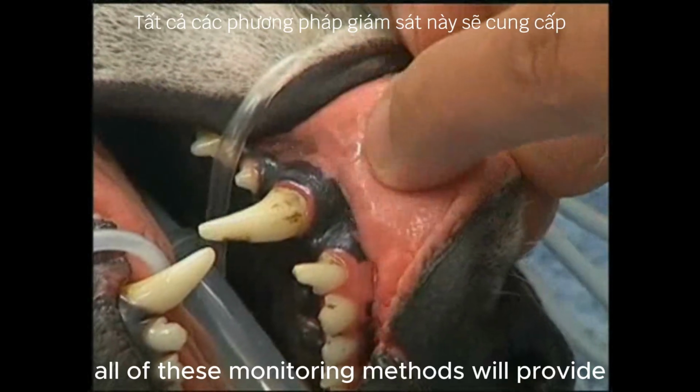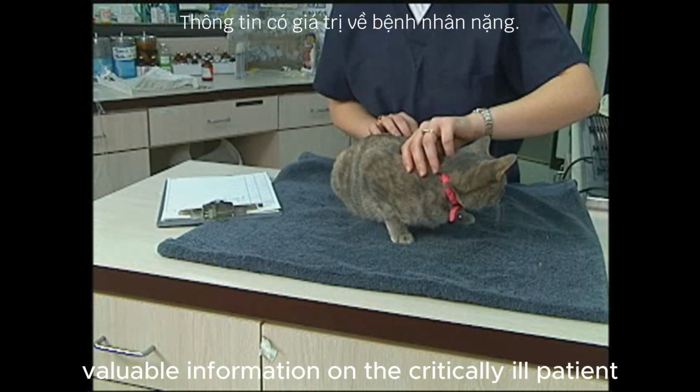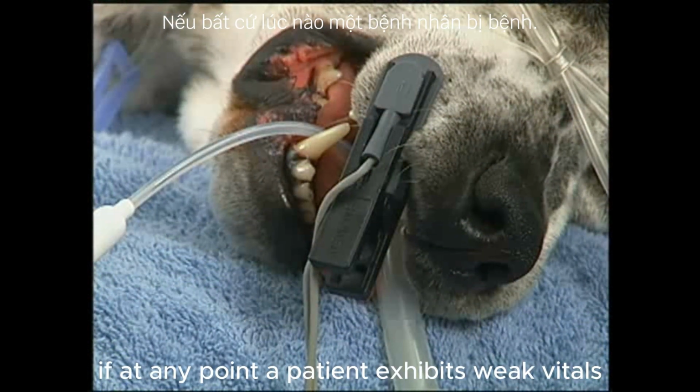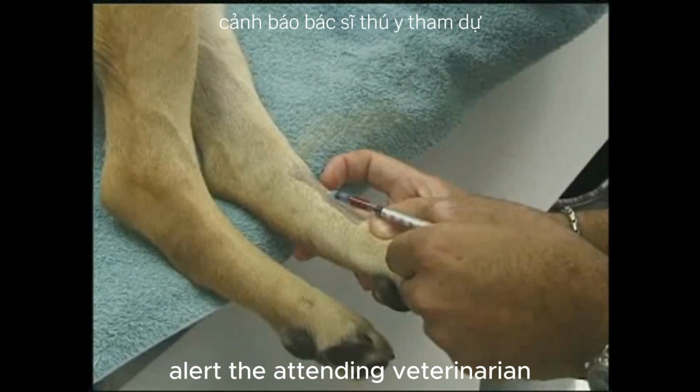All of these monitoring methods will provide the veterinary team with valuable information on the critically ill patient. If at any point a patient exhibits weak vitals or oxygen levels during supplemental oxygen treatment, alert the attending veterinarian.